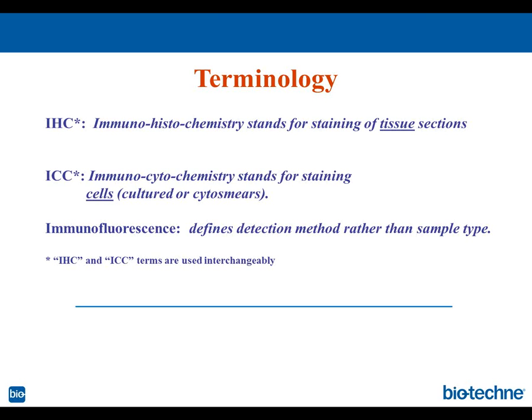One of the big challenges in immunohistochemistry is the situation when researchers are stuck with antibodies raised in the same host species. This is not unusual, and they cannot do their immunohistochemistry because the secondary antibodies they use will cross-react with all irrelevant ones, and they have a mess, overlaid images, overlaid colors, and they will not be able to identify the target of interest.